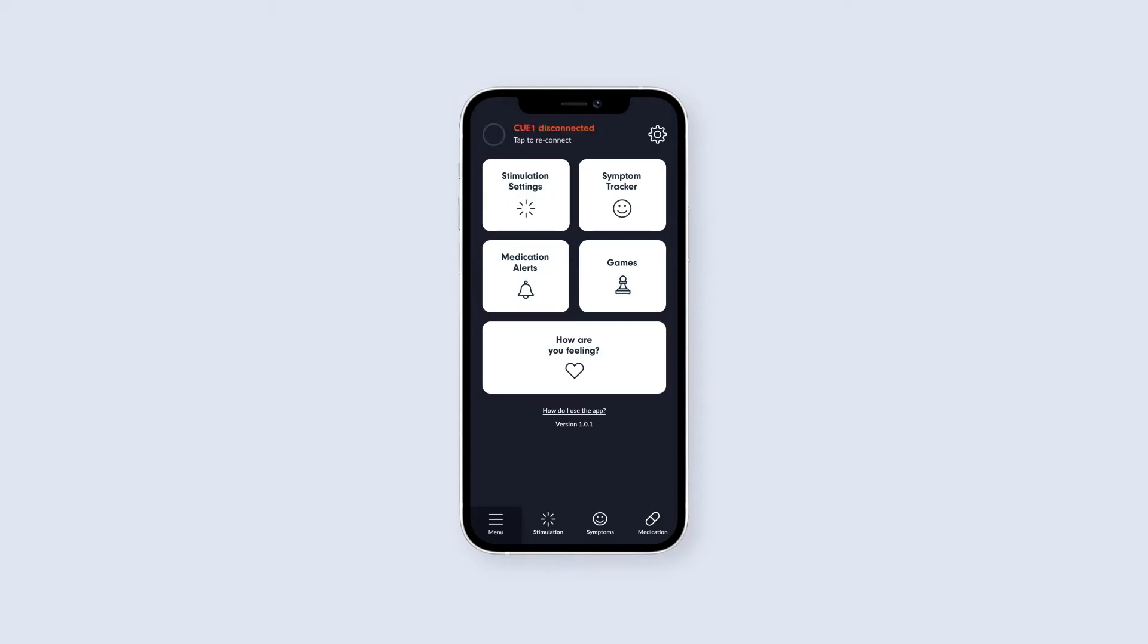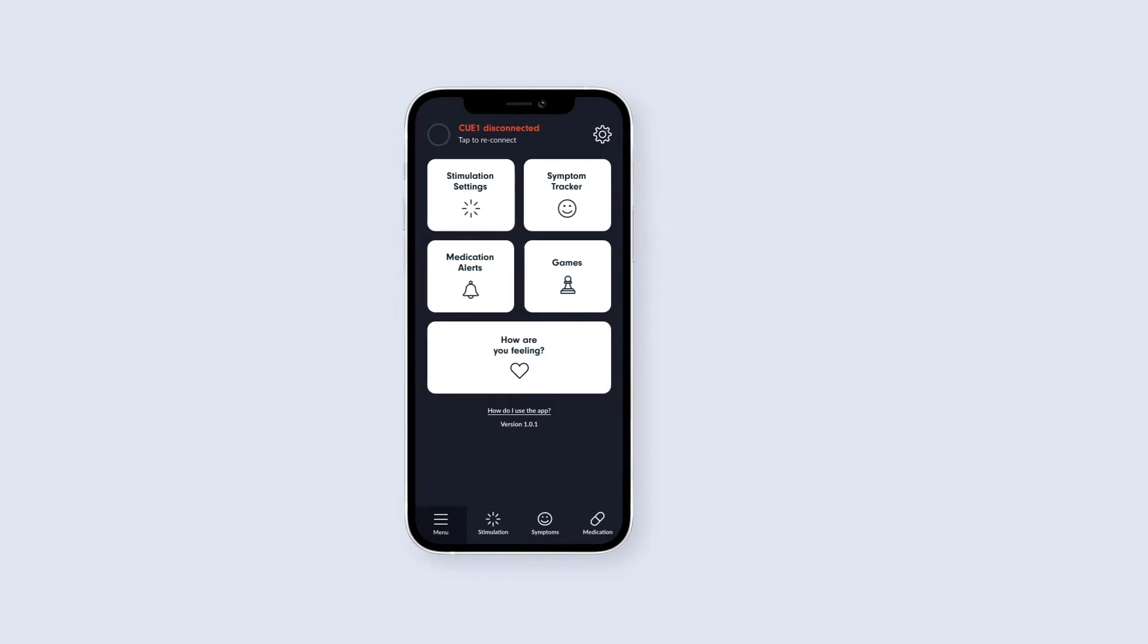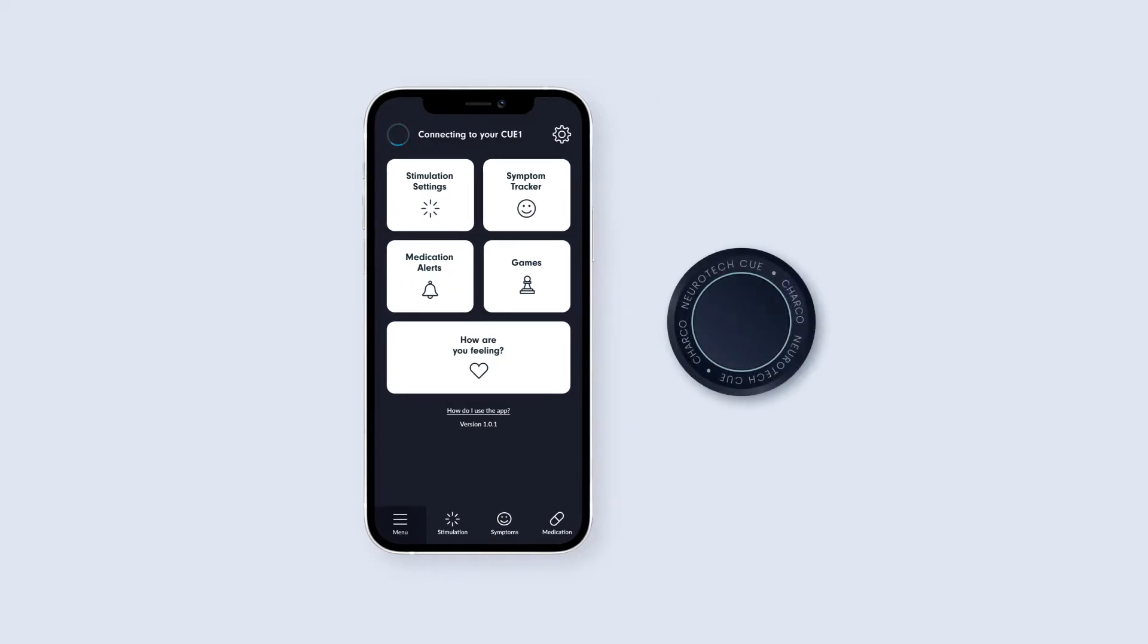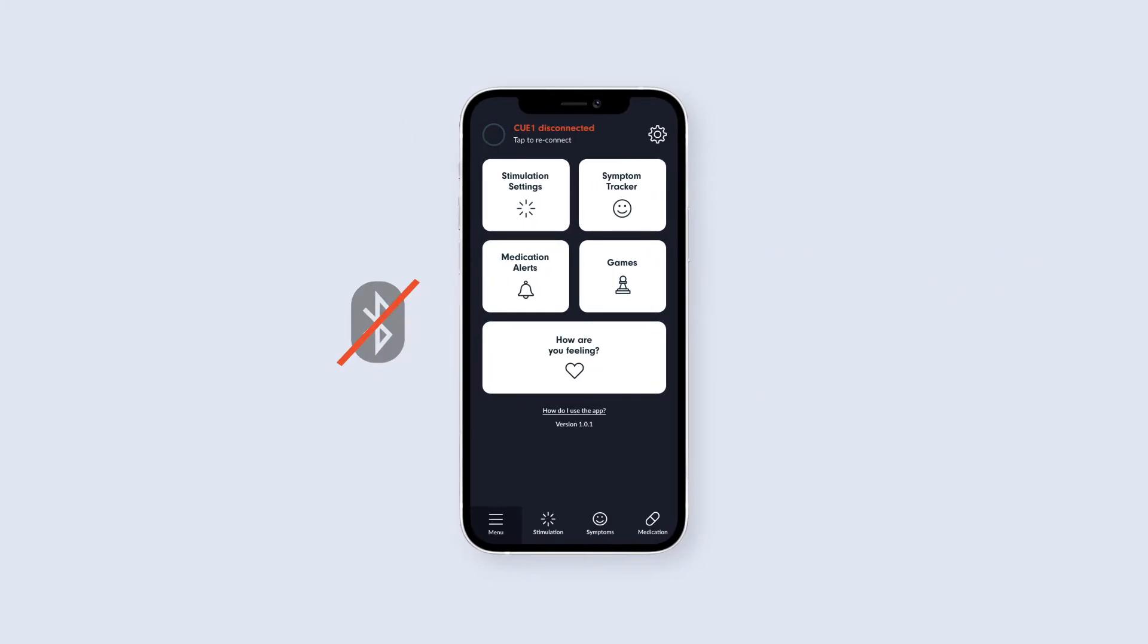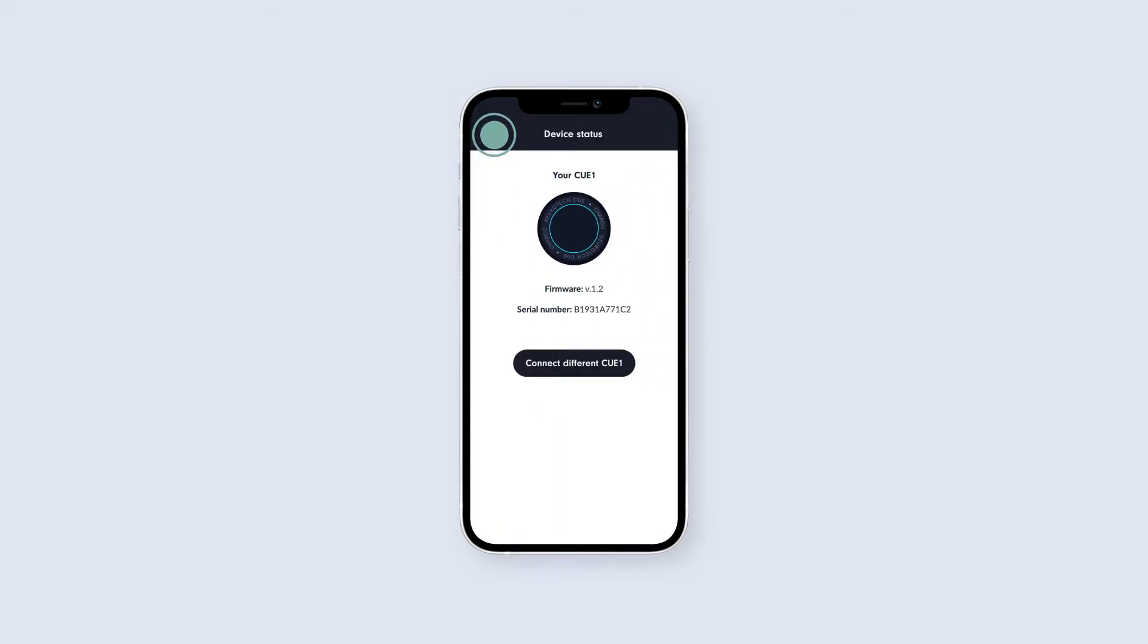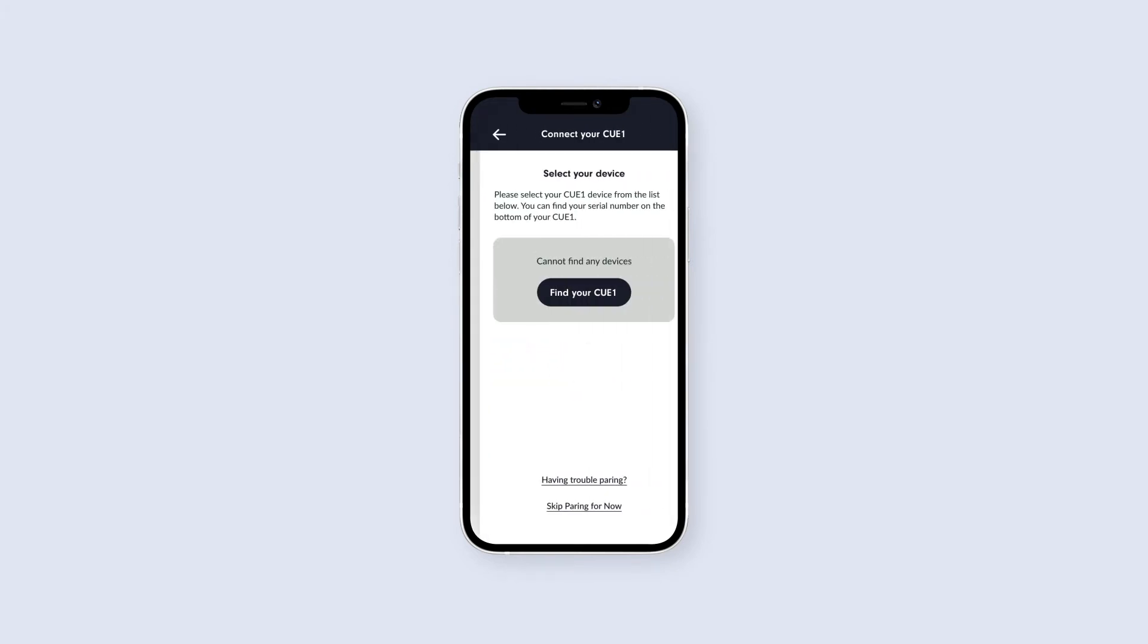If you ever need to repeat the connection setup process, for example to connect to a different Q1 device, or if you are having trouble connecting to your Q1, just press on the battery indicator at the top of the homepage to see the device status, and tap the Connect to different Q1 button.